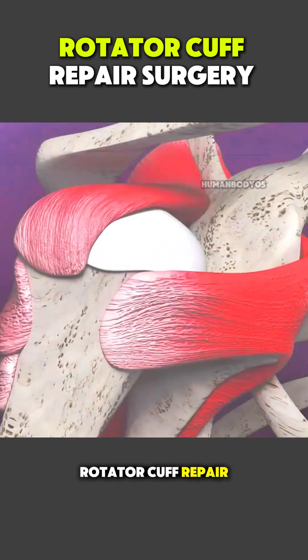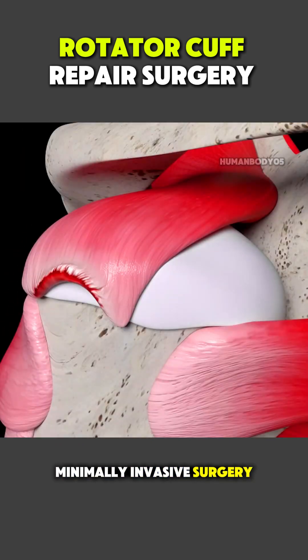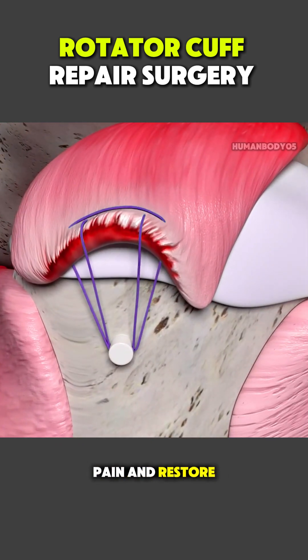Rotator cuff repair is a precise, minimally invasive surgery designed to reduce pain and restore shoulder function.